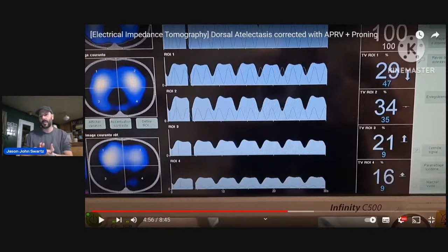And the fact that we have a P low at 0, when you look at the expiratory flow, that is an accurate representation of the person's lung mechanics. The minute your expiratory flow goes through a PEEP valve, it's not an accurate representation of your mechanics, but it's kind of like a flow rate. That's what I mean. So it gives you a lot more information.